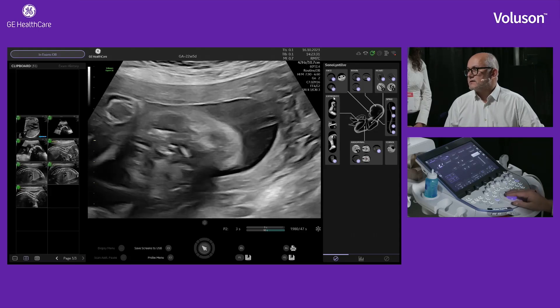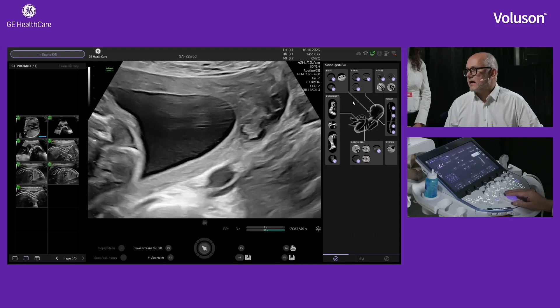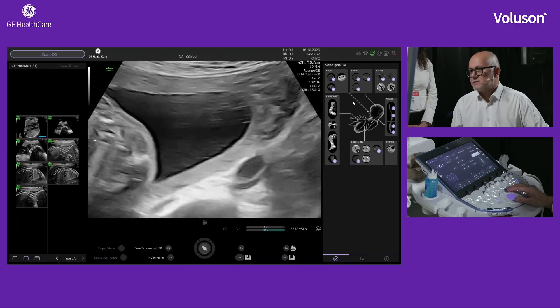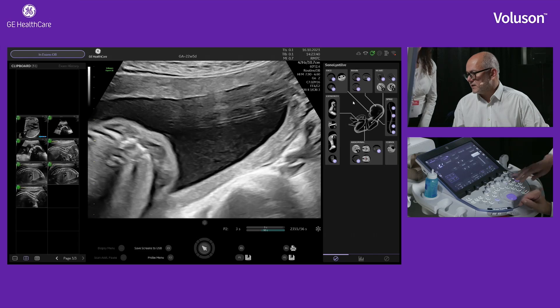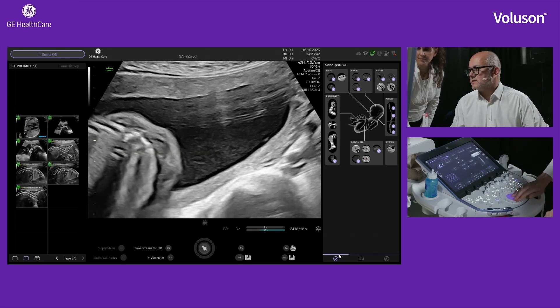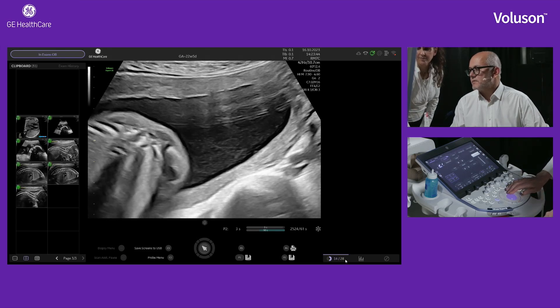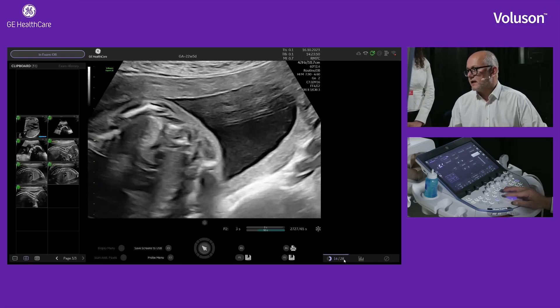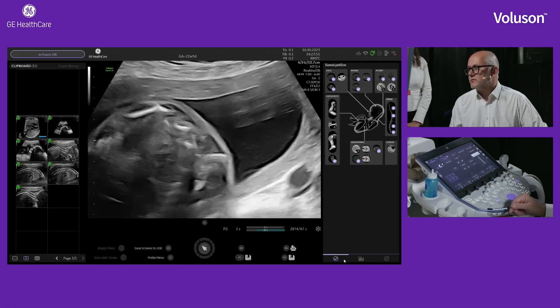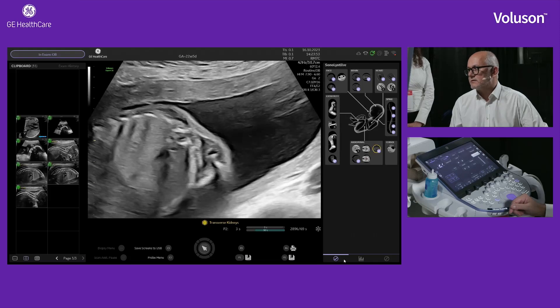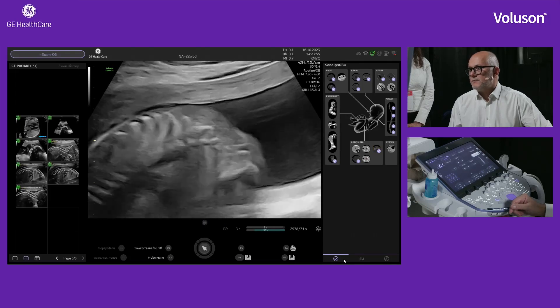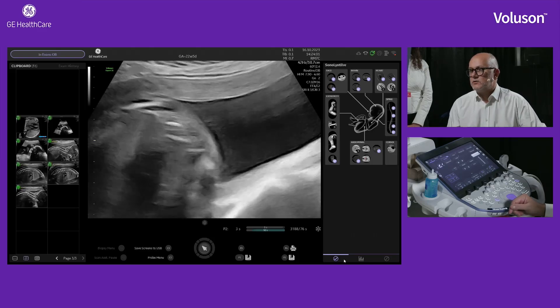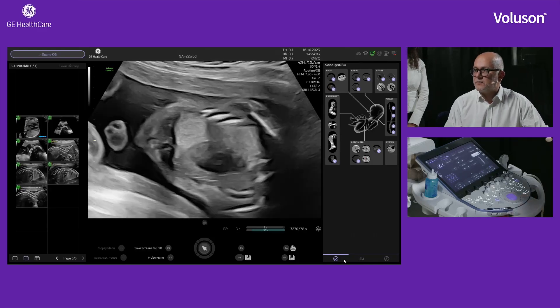I've got this in real time and can look at it at any time. If you don't like the cartoon baby display, you can go to the little pizza wheel from the earlier system — it's telling me I've got 14 out of 28 views, and if I click on it again it will show me which views are still outstanding. Our cardiac examination was far from complete.